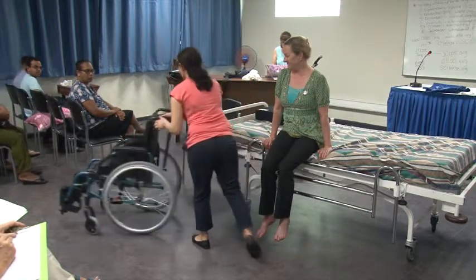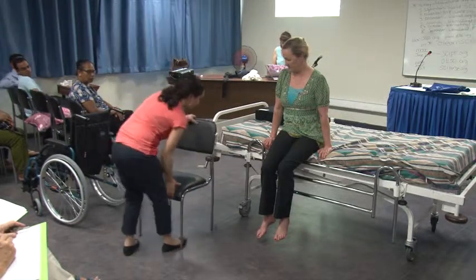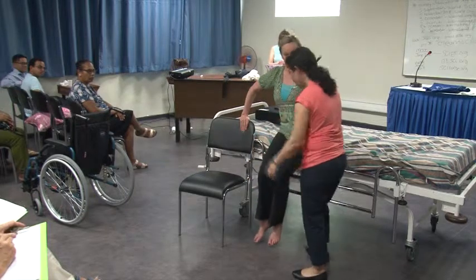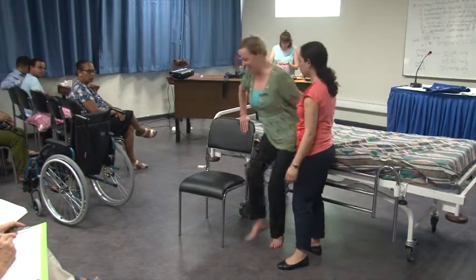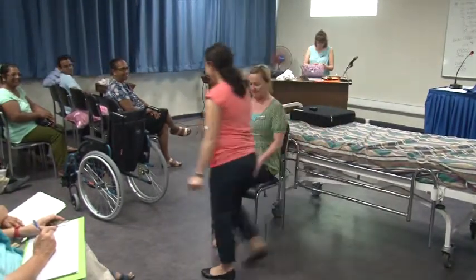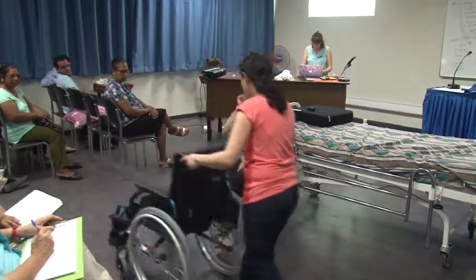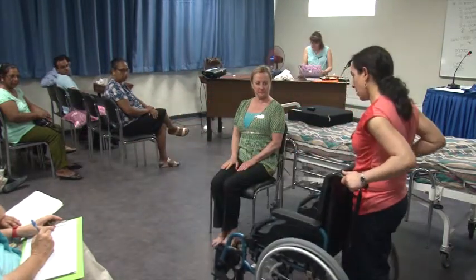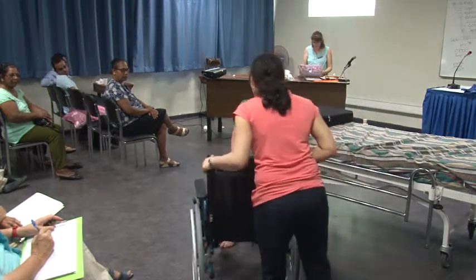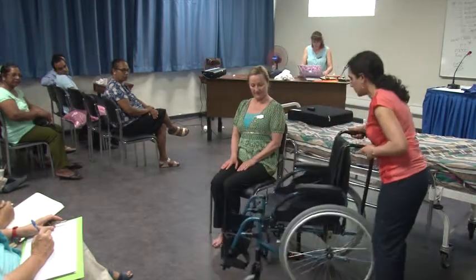we assume that this is a lower surface. So sorry, you can descend yourself in the chair. I'm not going to. No, that would be too dangerous to teach. So, as I said, position of the person, the short sitting, legs down, position of the equipment. Where are you going to place the equipment? Here, here. No, you place it as close to the surface as possible.